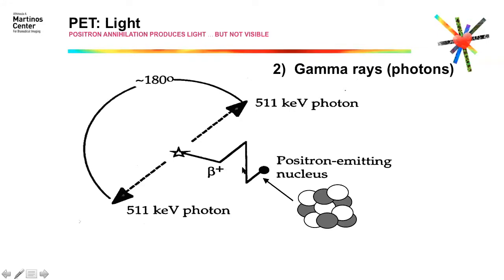If positrons have slightly higher energy, they will need to release that energy. And they release energy by moving in the same way as us. When we have a lot of energy, we go for a run or we do some sports and we release energy. Yeah. And that will have an effect, by the way, and I will talk about that. This distance is called the positron range.